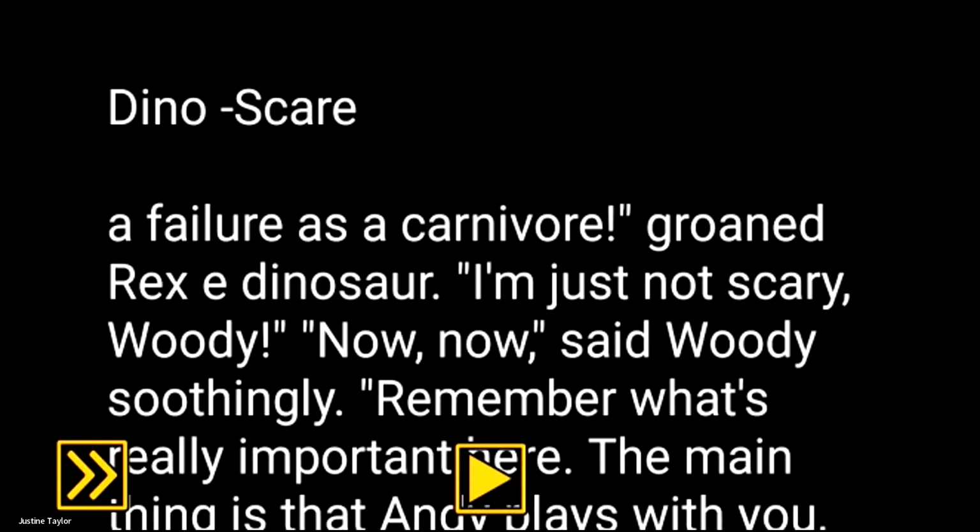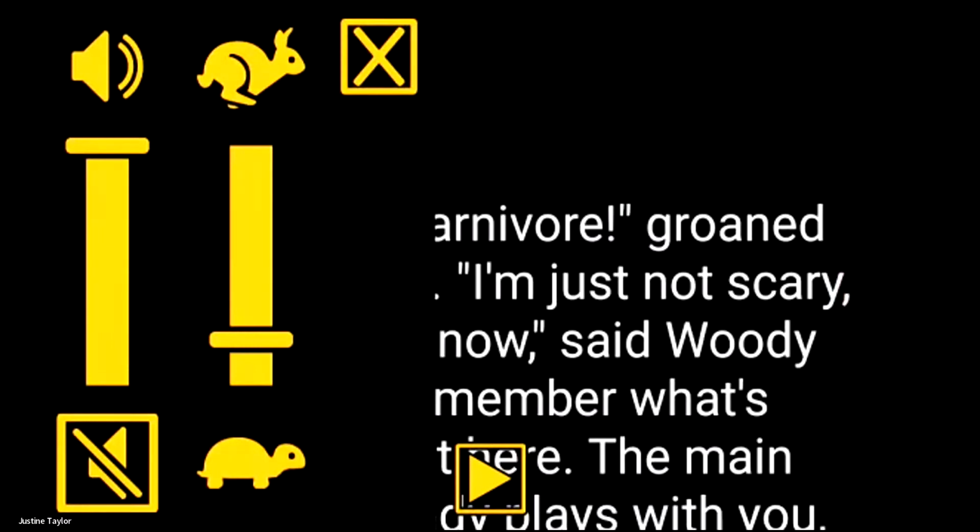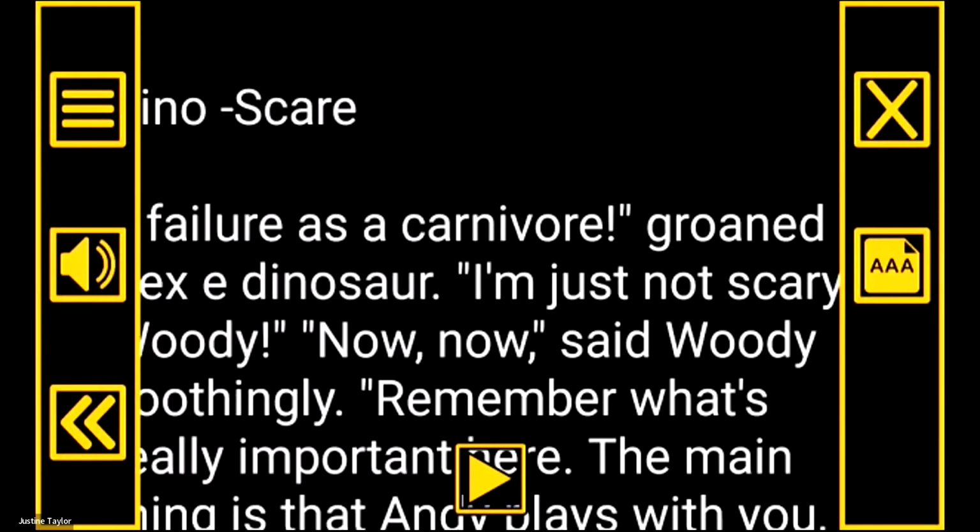Yeah, so let me show you, because we're in our story here. Let me show you how to change speech rate, and volume is really quick and easy to get to straight from your menu bars. So I open up my menu bars and we've got the middle left button, Volume, which is your volume and speech rate. Right there you can see I've got my volume on max here, so you can hear through my speakers, the OCR talk.